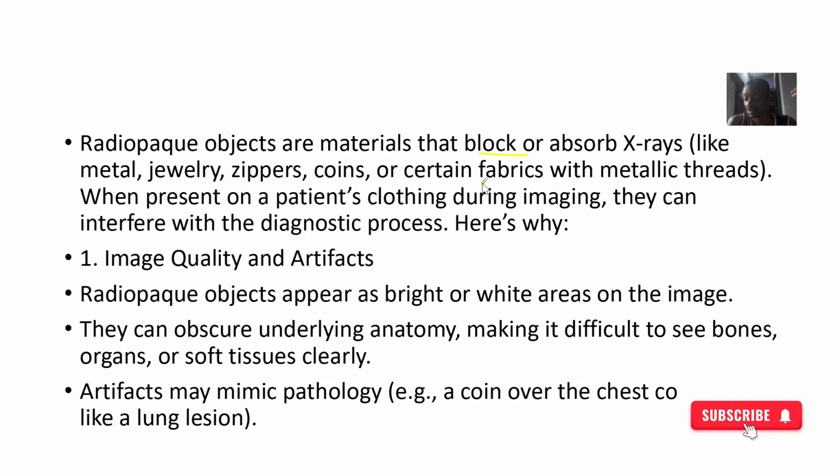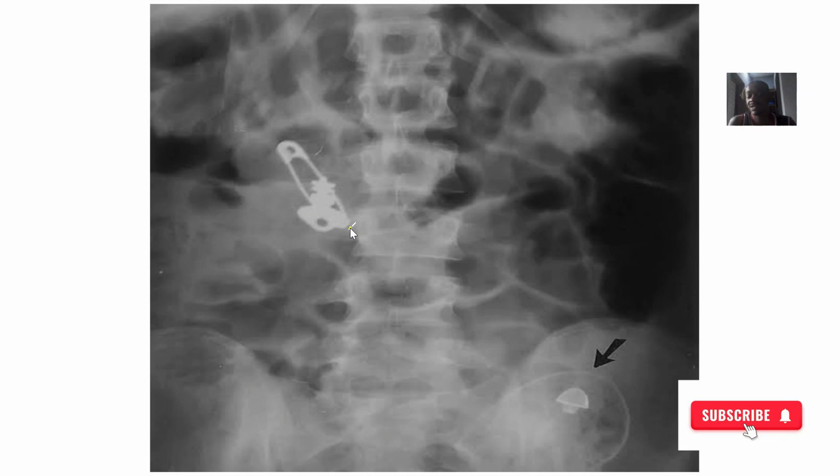Especially women, they wear a lot of fashion. So when those things are present on the patient's clothing during imaging, they usually interfere with the diagnosis. So what if there's a pathology behind this?